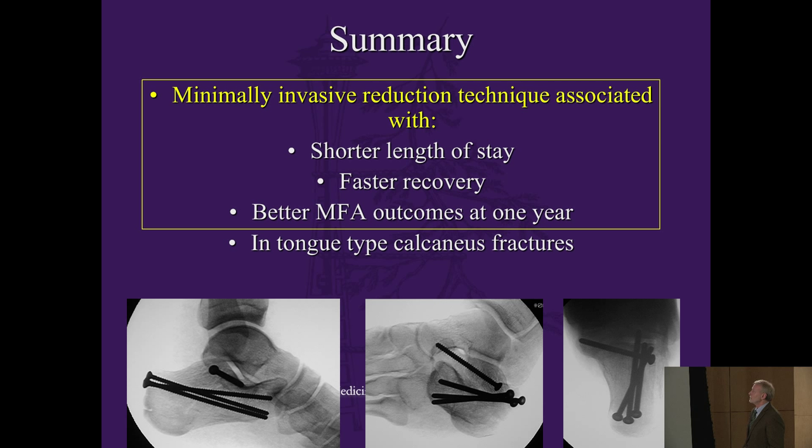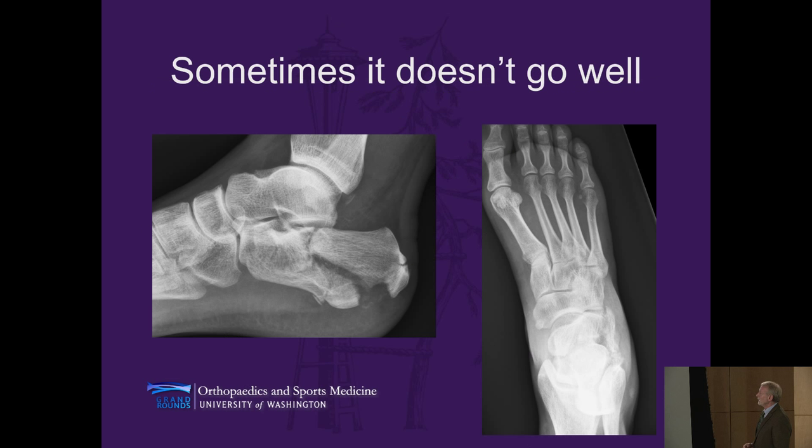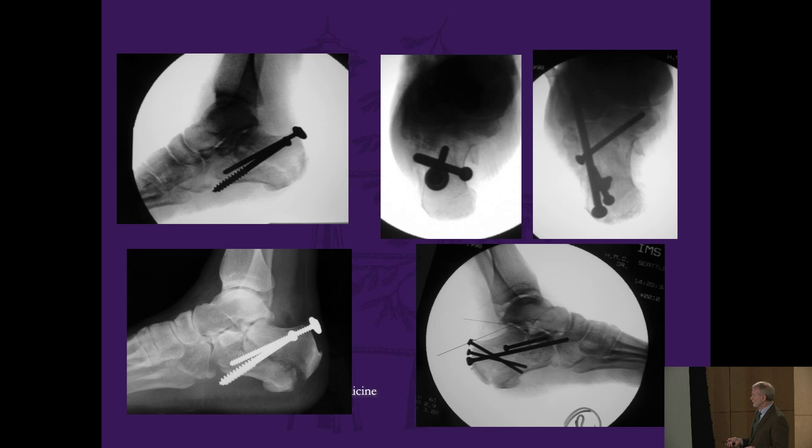I'm not going to tell you that it's good for all calcaneus fractures, but it should certainly be part of the armamentarium. And sometimes it doesn't go well. This is someone who came to one of our conferences, saw these x-rays, but had no experience doing calcaneus fractures. This is the result. I got it at 6 weeks with the screws not in the fracture, not reduced, and a much more difficult time restoring this back to something that the patient could walk on.